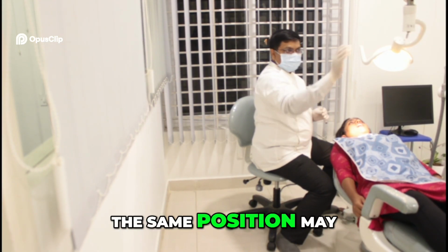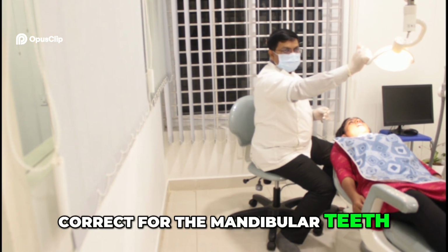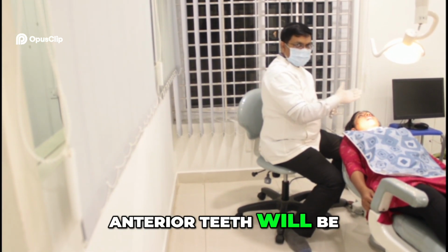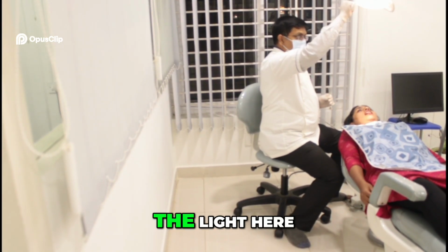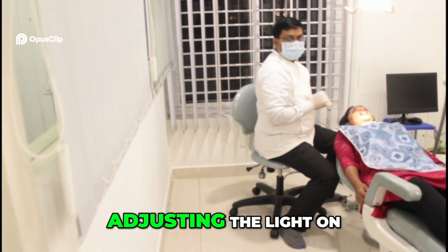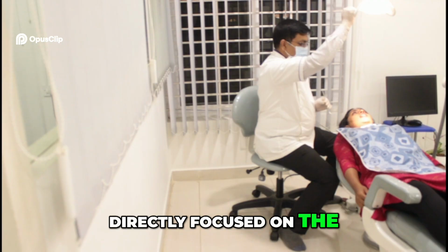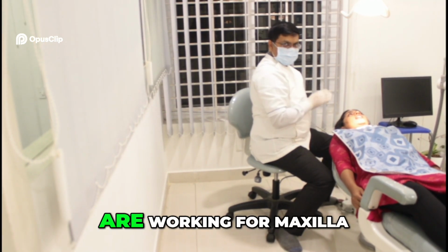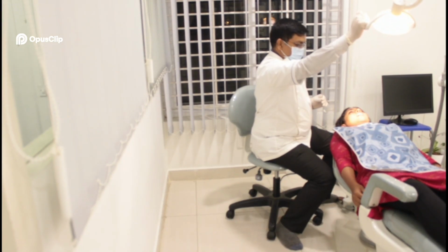The same position may not be correct for the mandibular teeth. If I keep this position for the mandibular teeth, the shadow of the anterior teeth will fall on the posterior teeth. So for the mandible, I'll be tilting the light here and adjusting it on the mandibular arch. The light will be directly focused on the mandibular arch. Depending on whether you are working on the maxilla or mandible, you can arrange the light position.